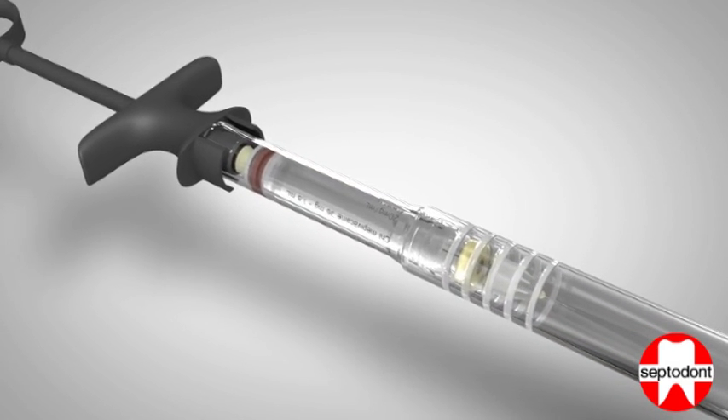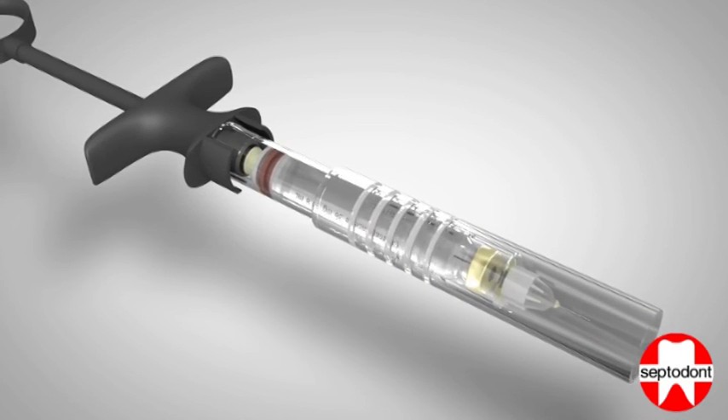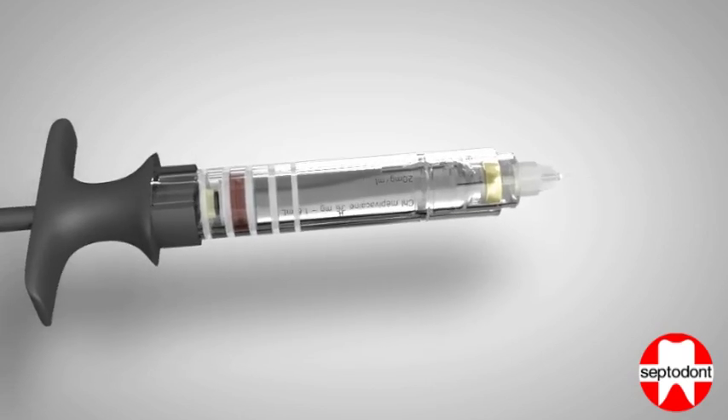When the device is required to complete the injection procedure, carefully slide the protective sheath back to expose the needle, as in step 3, and continue the injection procedure.